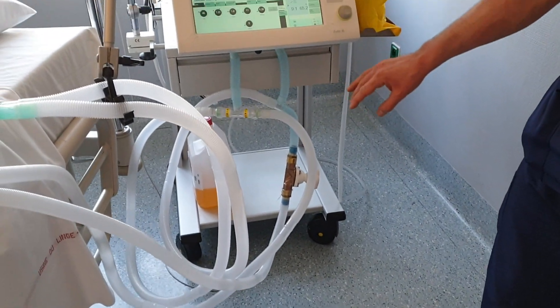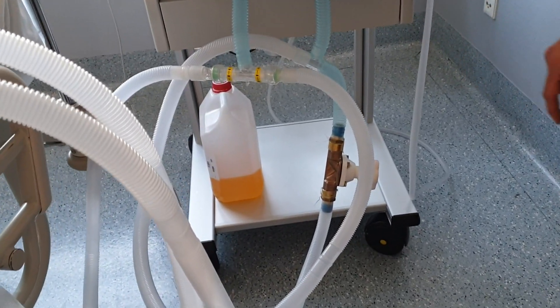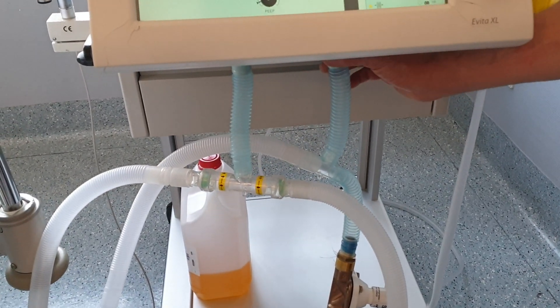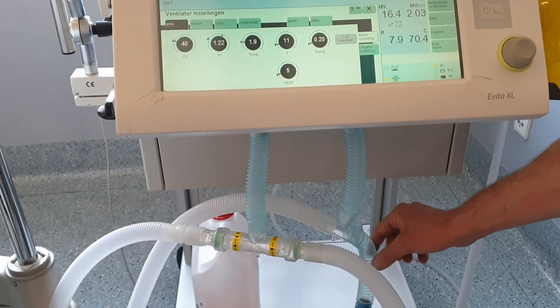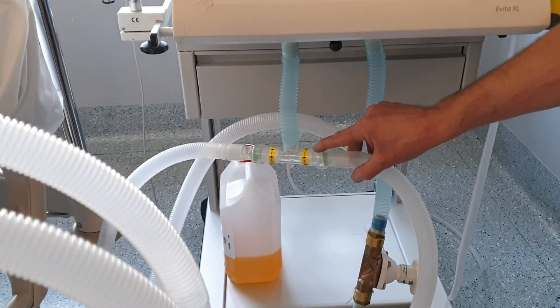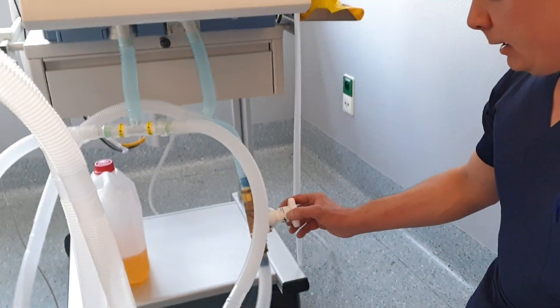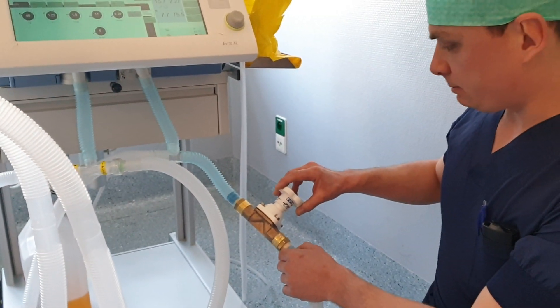This is a setup for two patients. You can easily extrapolate it to four patients. This is the inspiratory limb divided into other inspiratory limbs, expiratory limbs with one-way valves. We made a setup where you can adapt for compliance mismatch.